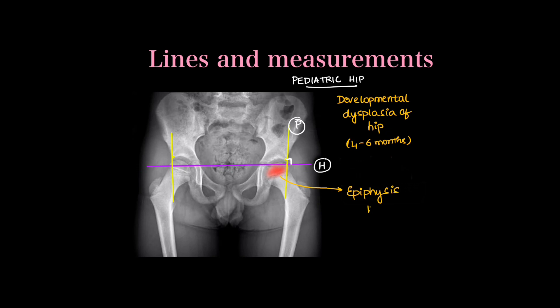To detect developmental dysplasia of the hip, we assess the position of the femoral head epiphysis relative to Hilgenreiner's and Perkin's lines. Normally, the majority of the epiphysis lies in the lower inner quadrant. If developmental dysplasia is suspected, the epiphyseal head majority lies in other quadrants — either the upper or outer quadrants.